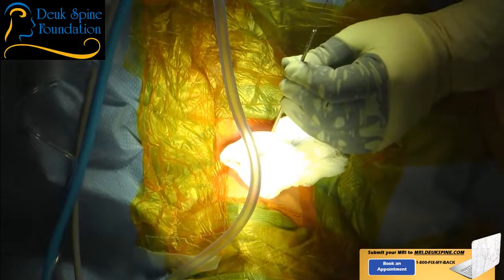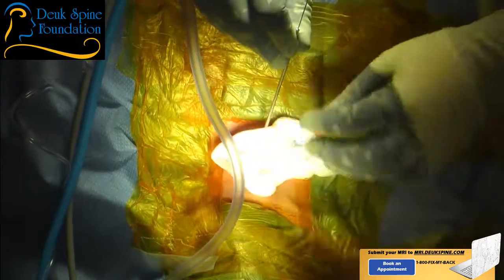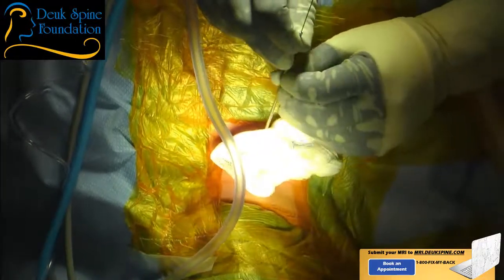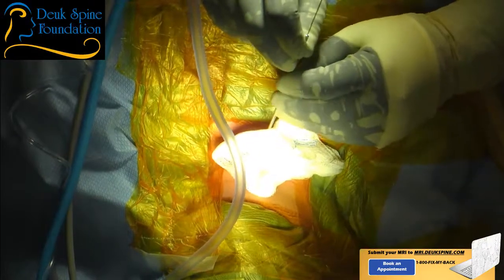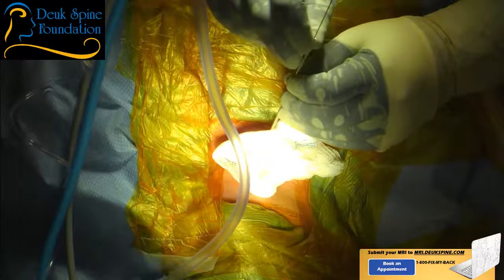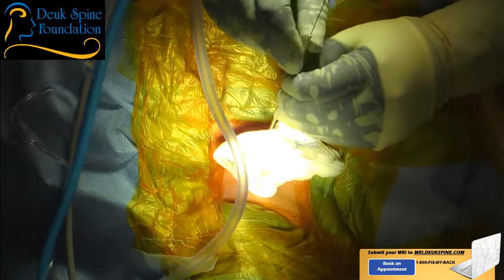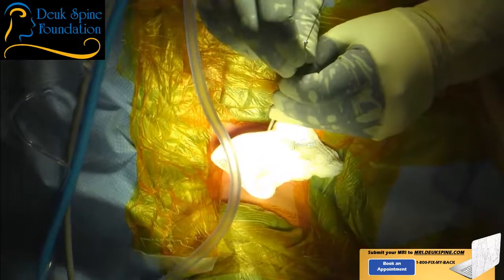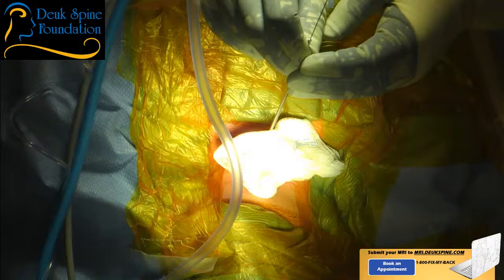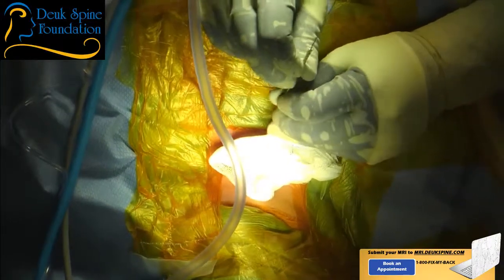It's perfect. And I'm going to now advance the dilator through the ALL. You can see we've had two drops of blood. As a matter of fact, really all the bleeding we've had is from me sticking the needle for injecting local into the skin to inject the numbing medicine. So really the bleeding is just from the injection of numbing medicine. All right, so I'm slowly advancing and I'm watching my guide wire.